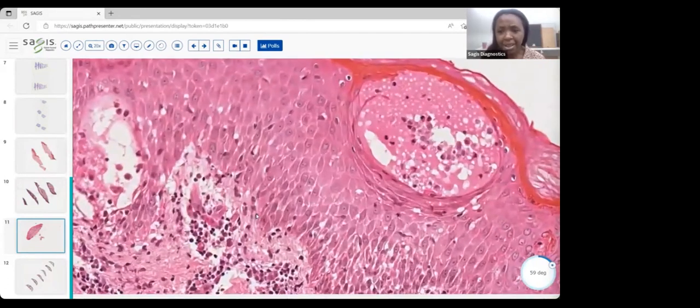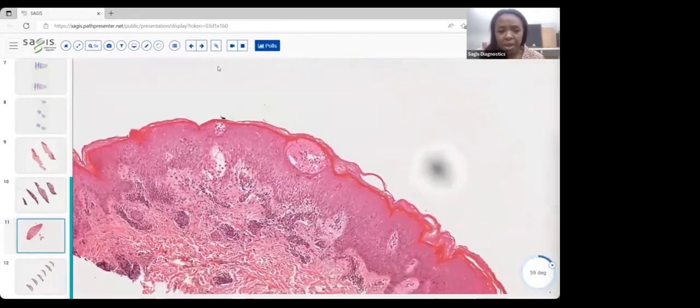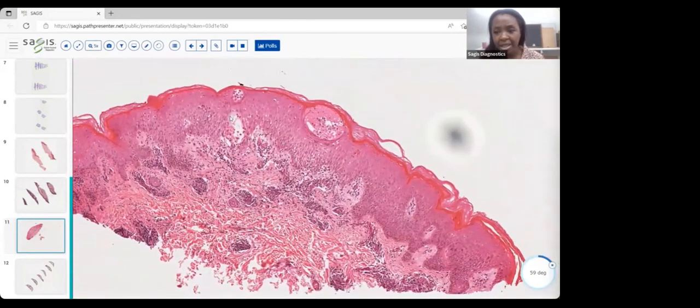We can imagine that this may be a diagnosis where the point is not so much that the virus is in the lesion, but this is an immune reaction or immune response to there being virus present somewhere. And this is one I'm including because it's interesting in that regard. This is Gianotti-Crosti syndrome, which certainly is considered more of a childhood syndrome, secondary to a viral infection.